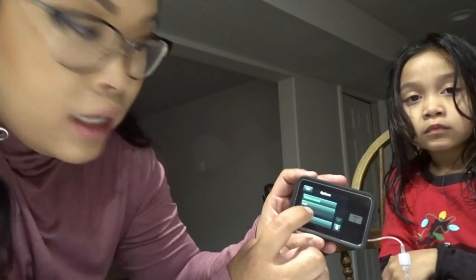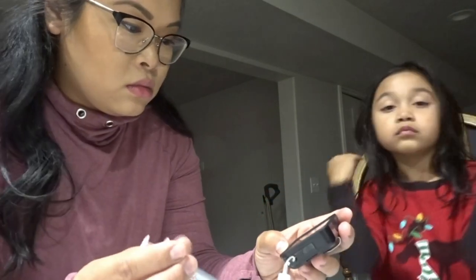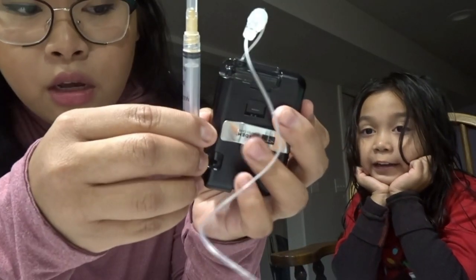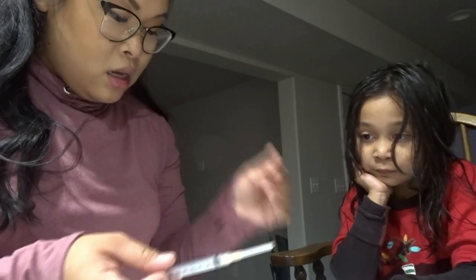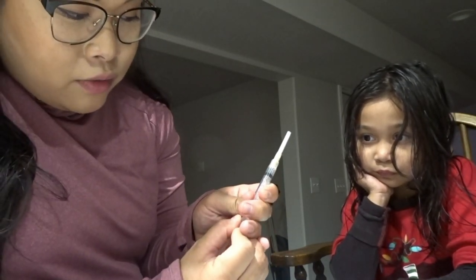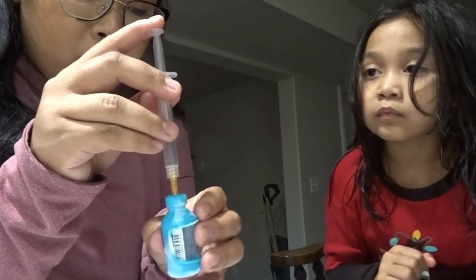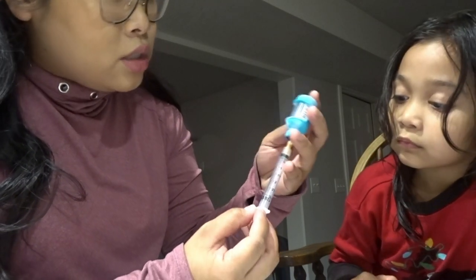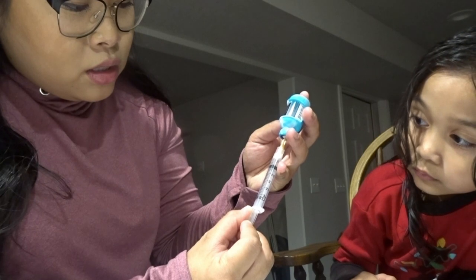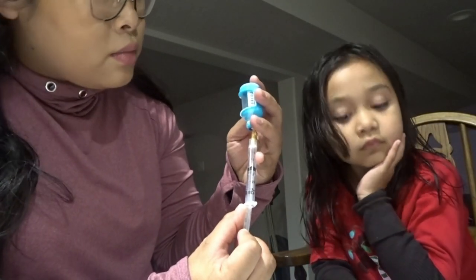We're going to unlock the pump options - I stopped the pump already - and go to Load, then Change Cartridge, and Continue. We're going to pop off the old cartridge; I just take the syringe, stick it in there, twist, and it pops off. Now I'm going to put air into the insulin vial - I go to one or just past the one line - push that into the vial, then turn it upside down and pull the insulin all the way out to the mark where I put the air in.